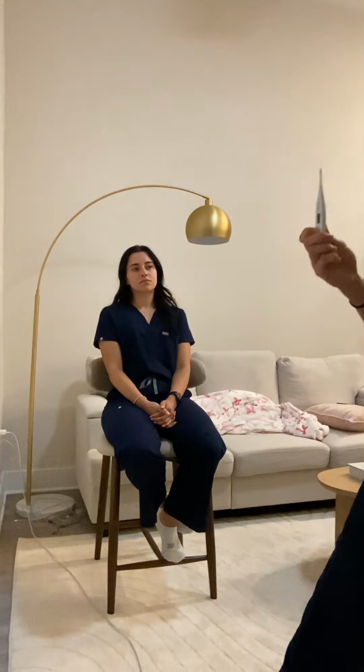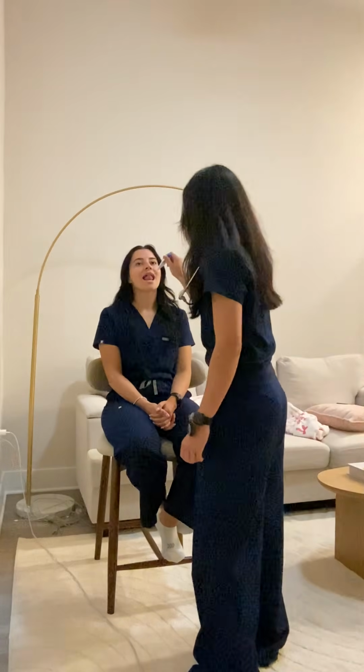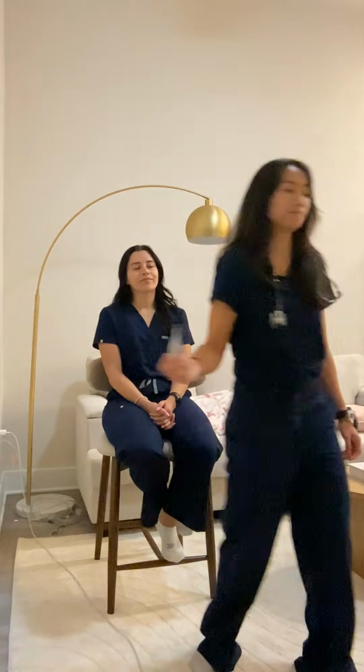And for now, I will begin by collecting the body temperature using an oral thermometer. I will use a guard, place it over the thermometer. Then I will turn the thermometer on, place it under the patient's tongue, wait for 1 minute to elapse or until the thermometer beeps. Alrighty.